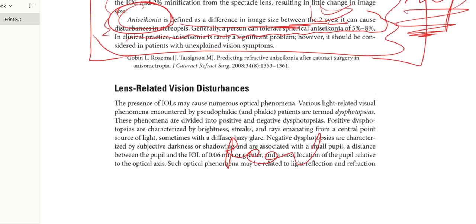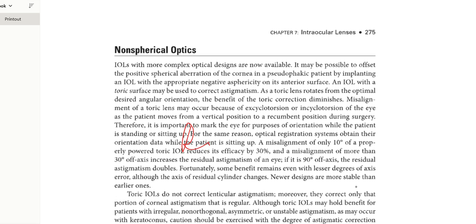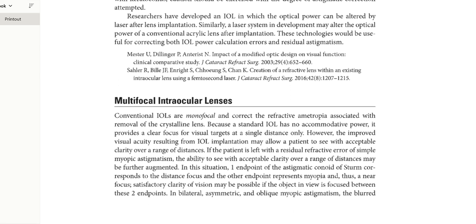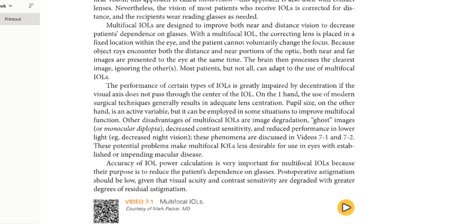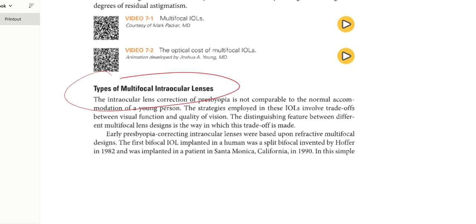Course to this topic. A quick read. Multifocal intraocular lenses. Only a read will be enough. In which conditions the multifocal intraocular lenses are not suitable? Read here. Only a read will be enough.